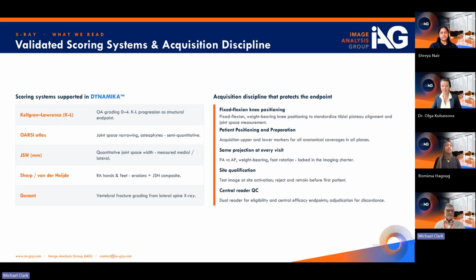If you're starting then to look at these patients over time and see drug progression and any safety markers, you'll start to look at joint space width measurements, so if there's any narrowing within the joint space.